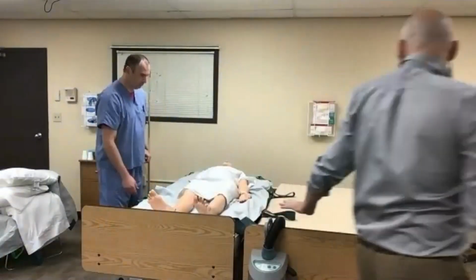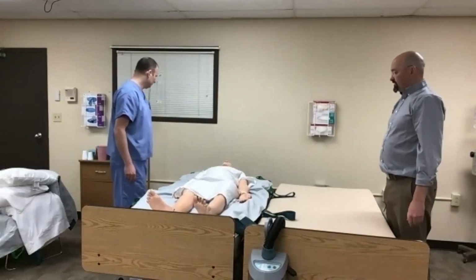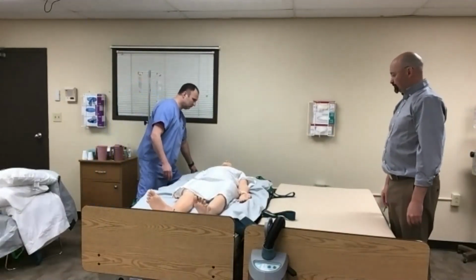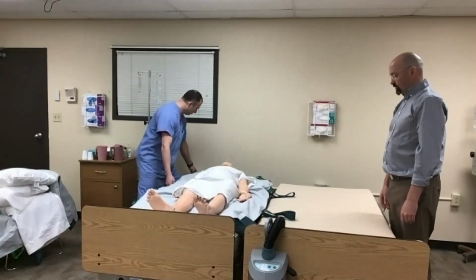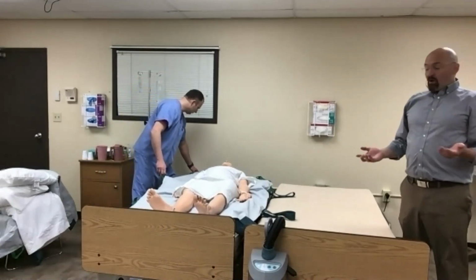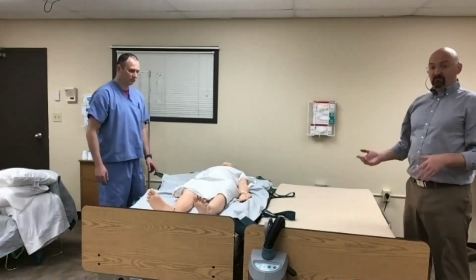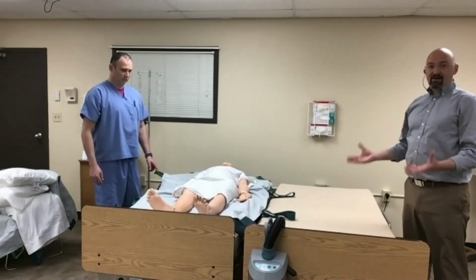So we're going to start by doing a lateral transfer with our air transfer device. We're going to always have somebody holding onto the HoverMatt on that side. Wonderful. Going from a slightly higher to a slightly lower position. Ironically, we've always said, make sure you always go feet first and then head first whenever we're doing a lateral transfer. Now I'm going to show you why.